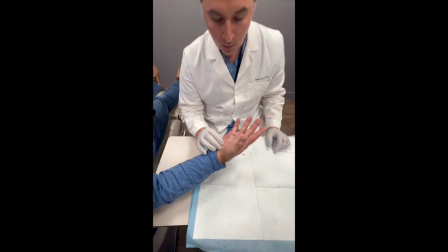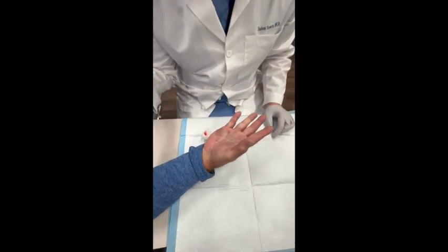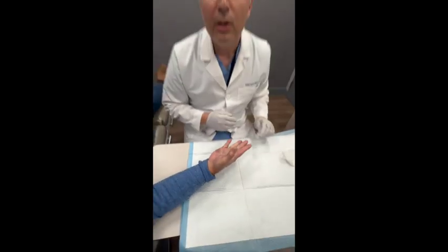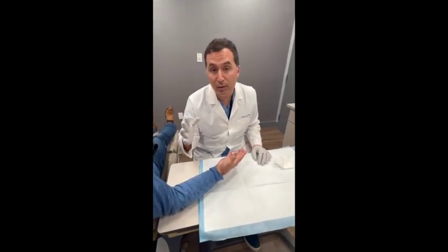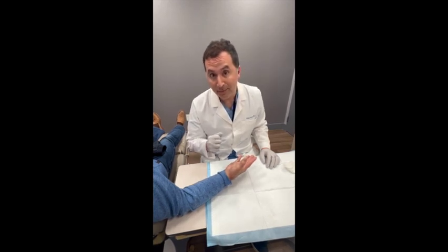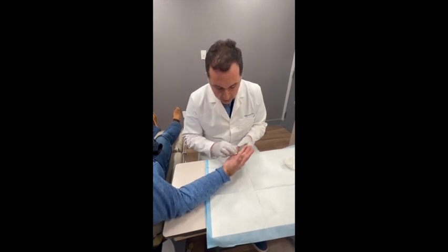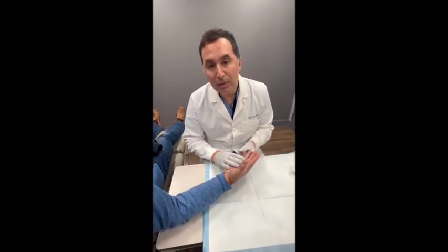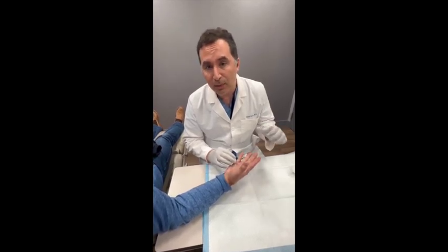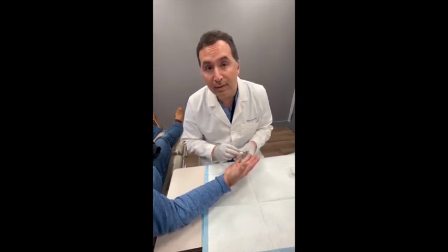If you look at his hand, it's now more open. You can stretch your fingers out, and you can bring them in. Open. Success. We've successfully ruptured the Dupuytren's cord that was holding the small finger in flexion. His finger is now free. I'm going to simply put a bandaid over this and then a splint to keep his finger straight for a few days. But then he can get back to what he likes to do quickly, and his Dupuytren's contracture is treated successfully.